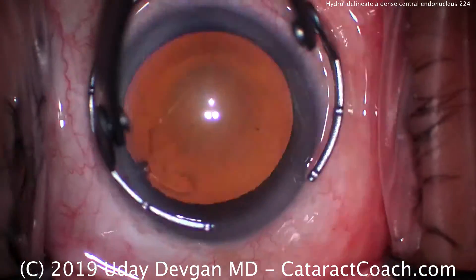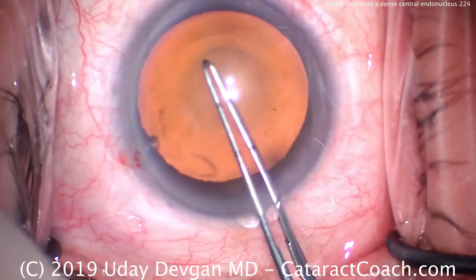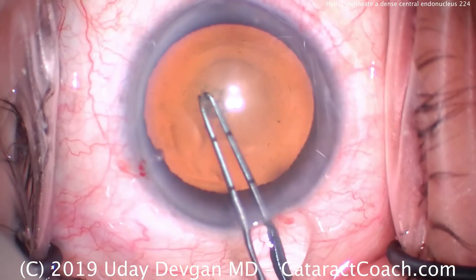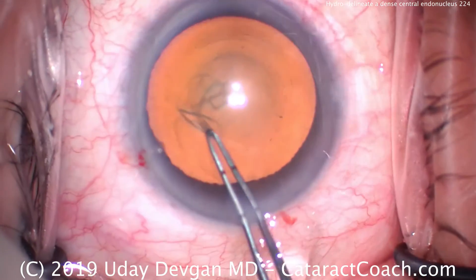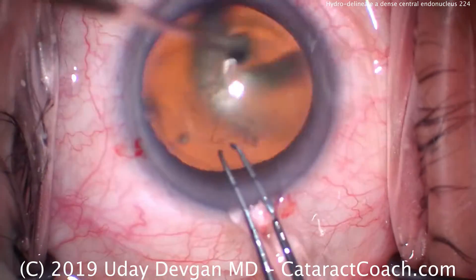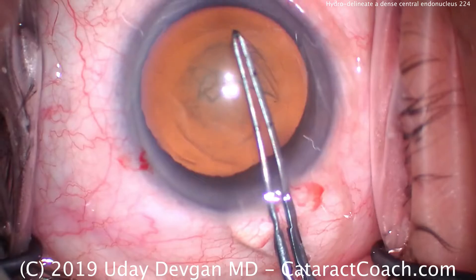When we do our surgery here, we want to separate out that dense central endonucleus. That's going to be removed very easily with the phaco probe and the chopper, while the rest of the epinuclear shell is going to serve as a barrier. Then that epinuclear shell can be aspirated out of the eye with essentially no phaco energy.